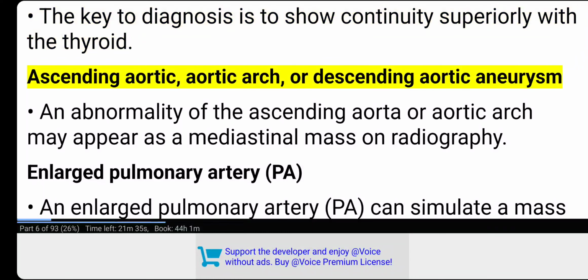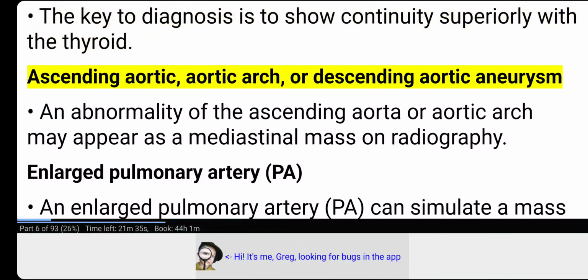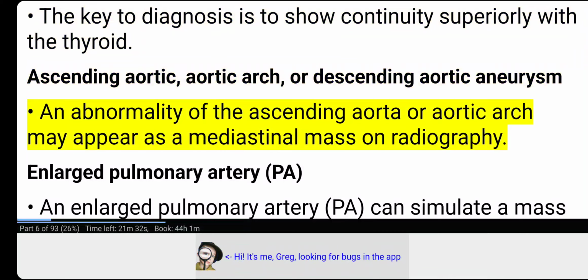Ascending aortic, aortic arch, or descending aortic aneurysm. An abnormality of the ascending aorta or aortic arch may appear as a mediastinal mass on radiography.